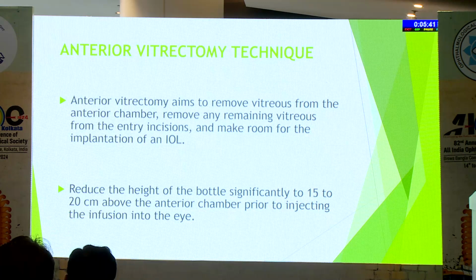If flow is more and your cannula is towards the posterior pole, more vitreous will get hydrated and more vitreous will come anteriorly while doing anterior vitrectomy. First thing is to reduce the flow rate.